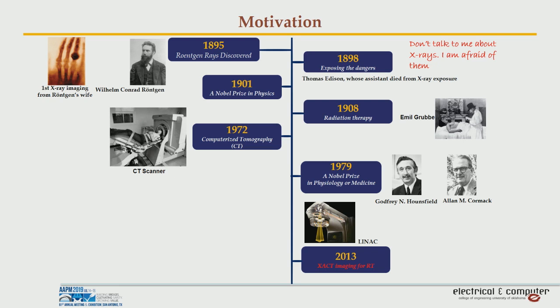I was encouraged by Dr. Wang's presentation. They did fantastic work there, which gave us more confidence to move this technology towards the clinic. And in 2016, we demonstrated another system which showed that we can possibly reduce radiation dose, but still get a very high quality 3D volumetric image with a single X-ray projection.